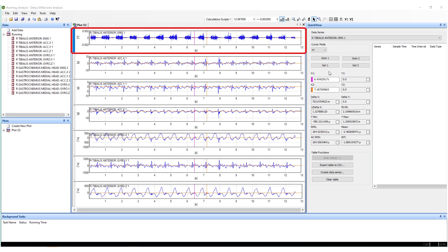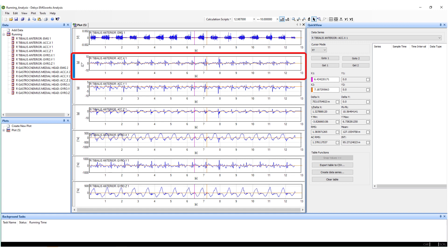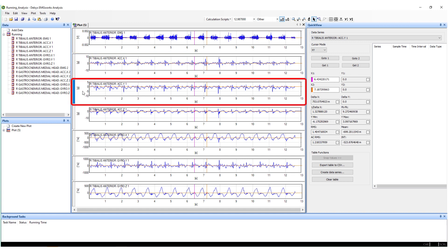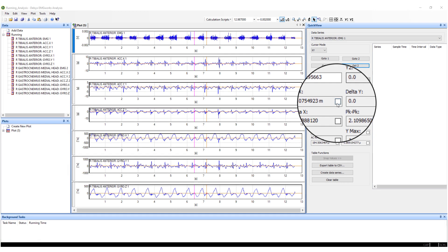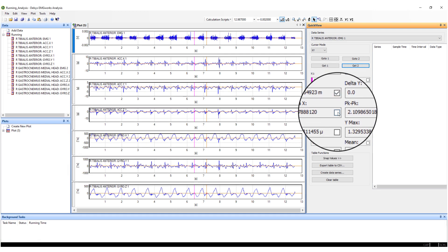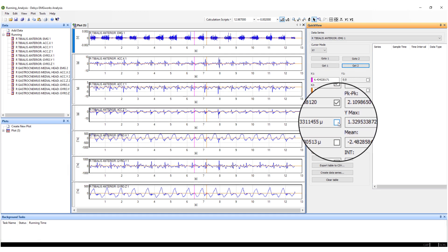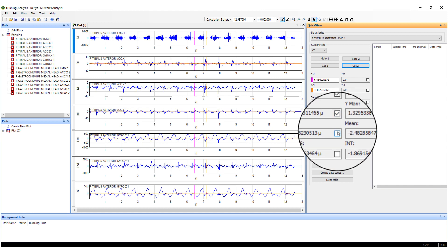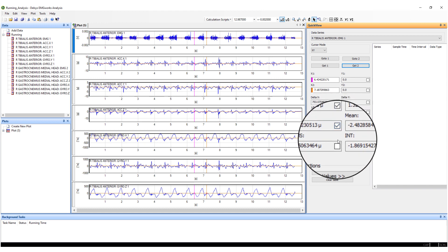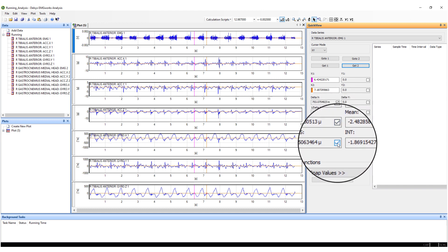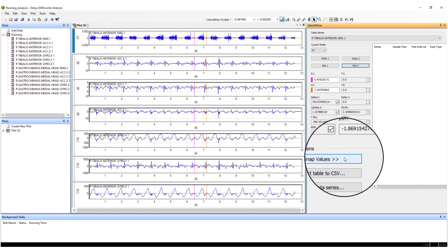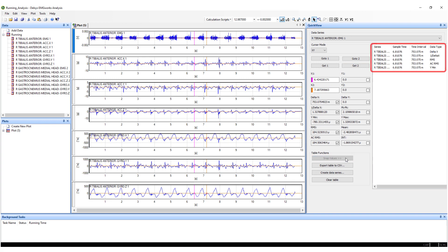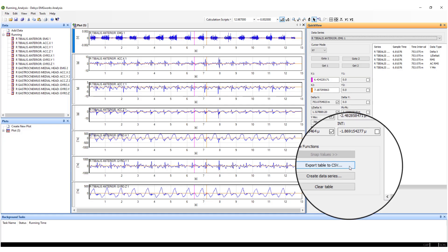To view the data metrics from separate data series, left-click within the data channel, and the Quick View time-windowed metrics will automatically update. By selecting different metrics, the corresponding values can be exported for SNAP values within EMG Works Analysis or as a table within Excel as a CSV export.